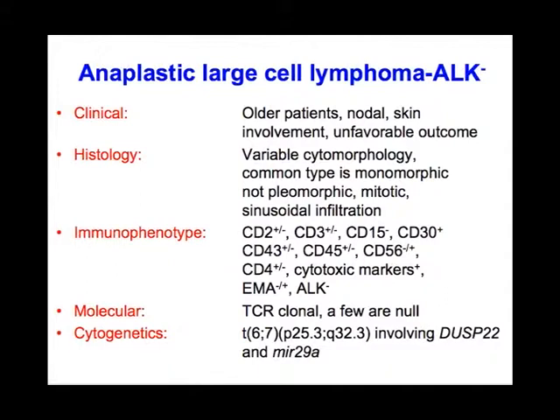The way I think of this disease is I look down the microscope and see the H&E, and I think anaplastic large cell lymphoma. And then the next thing I do is check whether it's ALK positive or negative. So most of the cases that I call ALK negative ALCL are strong and uniform CD30 positive, but by definition are ALK negative. And they're the cases I would have bet one of my colleagues a cappuccino or a latte that this is going to be ALK positive, only to find out it isn't. So that's the way I use this category of ALK negative ALCL.